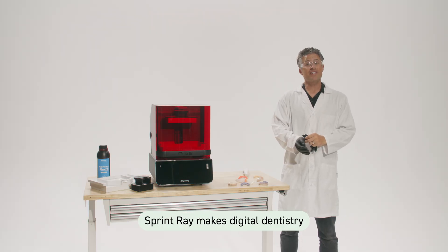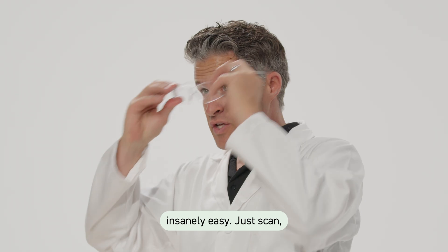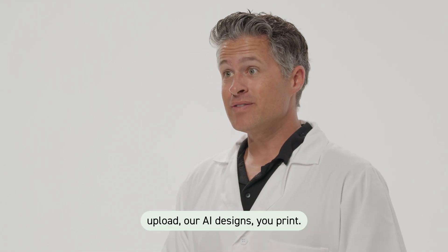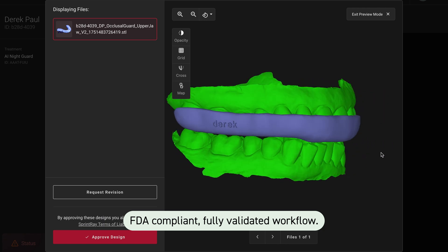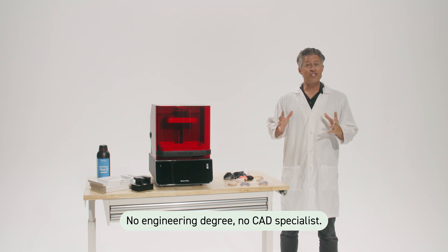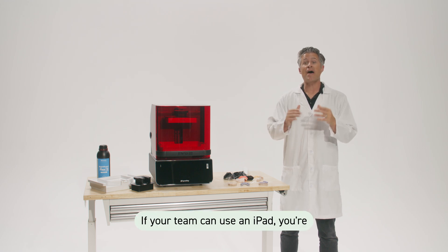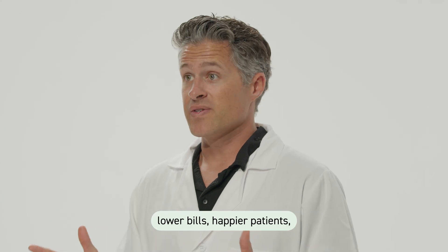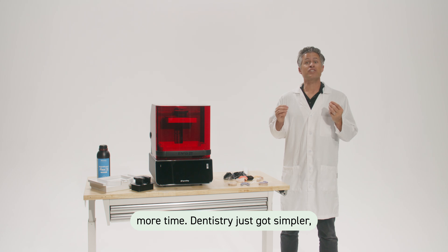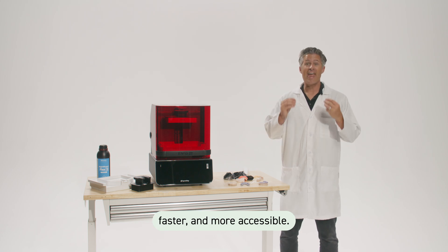SprintRay makes digital dentistry insanely easy. Just scan, upload, our AI designs, you print. FDA compliant, fully validated workflow — no engineering degree, no CAD specialist. If your team can use an iPad, you're good. Same-day care, lower bills, happier patients, more time. Dentistry just got simpler, faster, and more accessible.